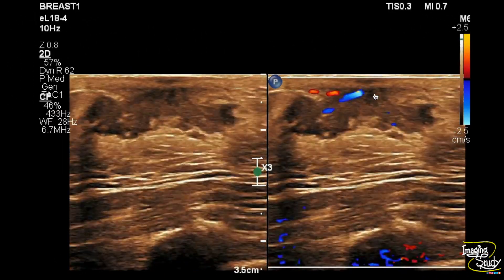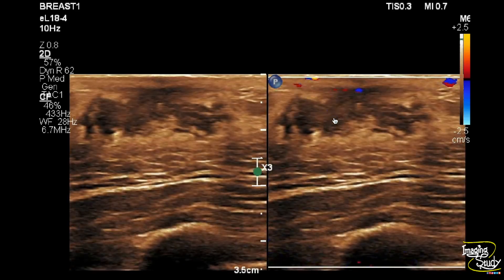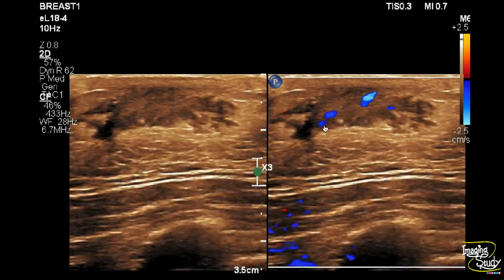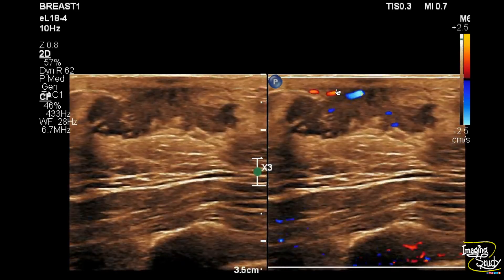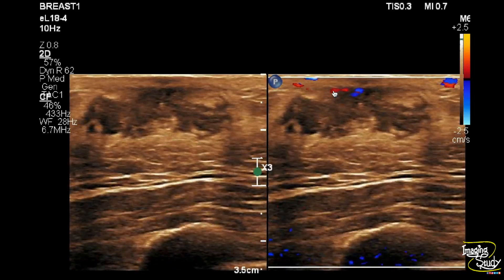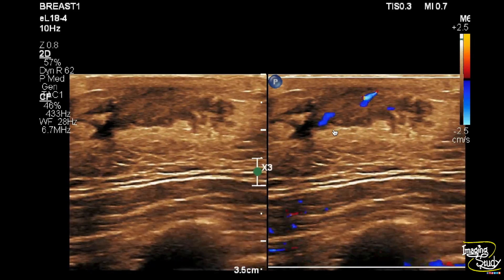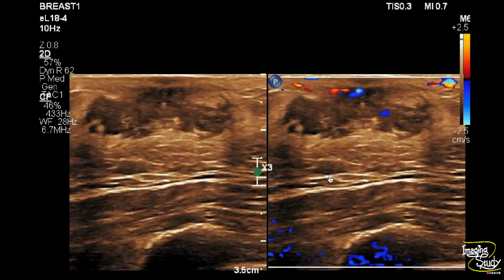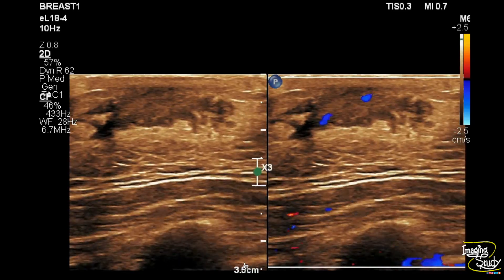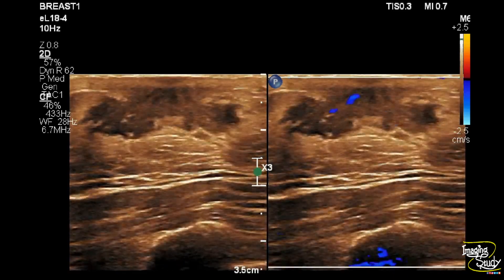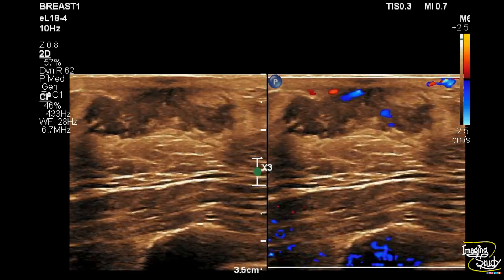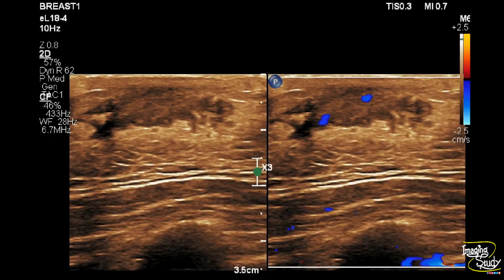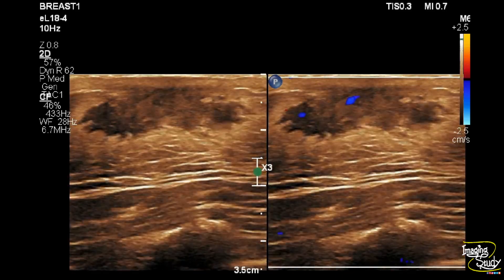We applied color Doppler and you can see the vascularity in comparison to the right breast is increased. This proliferation of the mammary layer with fat plane irregularity and increased vascularity indicates gynecomastia with mastitis.